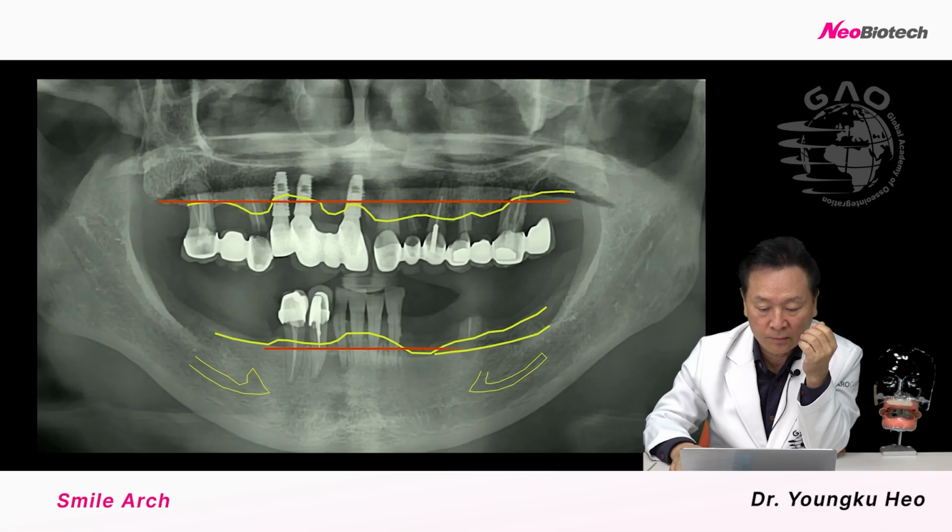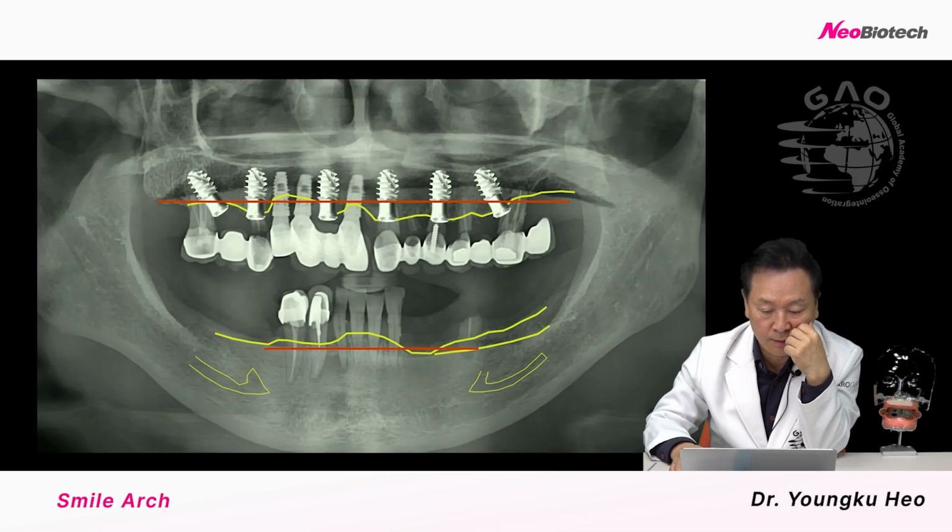So we need bone reduction and also extraction of all the teeth and problematic implants, everything.